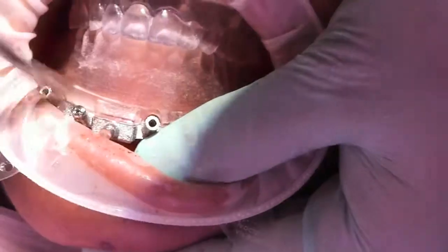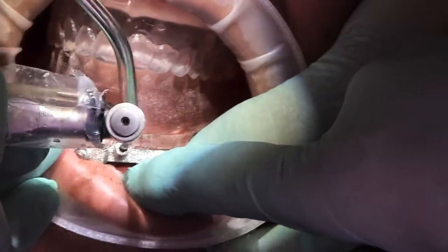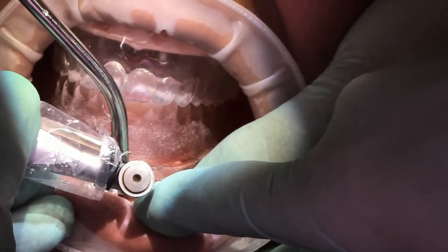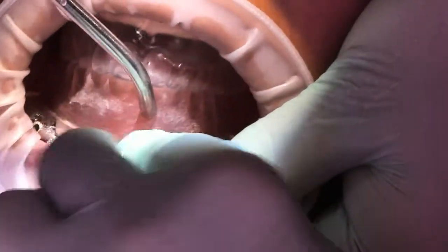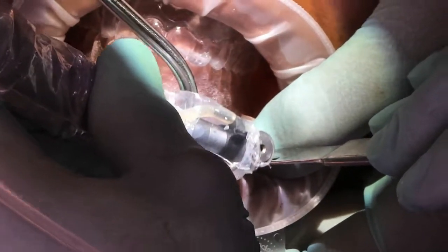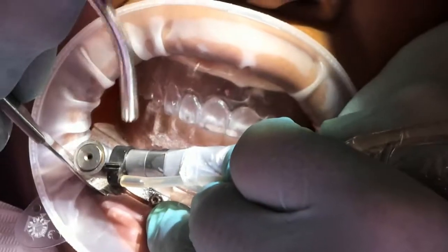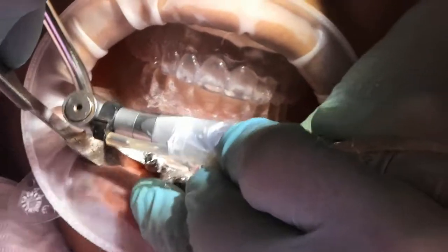Then they are removed from the mouth and they are assembled with the fixation bases. And with both assemblies, they are reinserted back into the mouth, and the patient's mandible and head are held together while the sites are drilled. Drill all the sites, mandibular and maxilla, and place pins in one at a time. With all the sites drilled and the pins seated, remove the mandibular pins, remove the fixation base and the pin guide, and the mandibular now is on hold until the maxilla is finished.